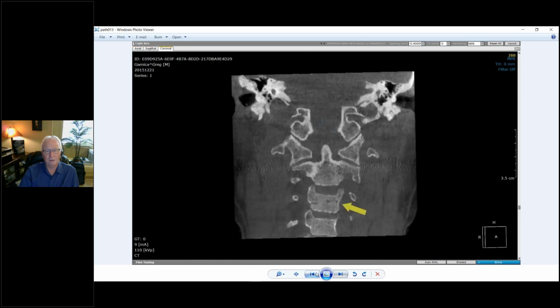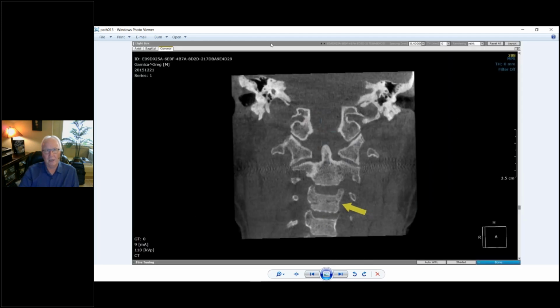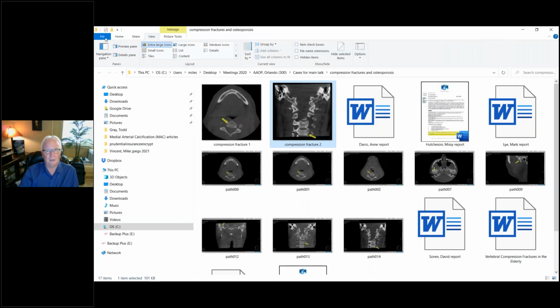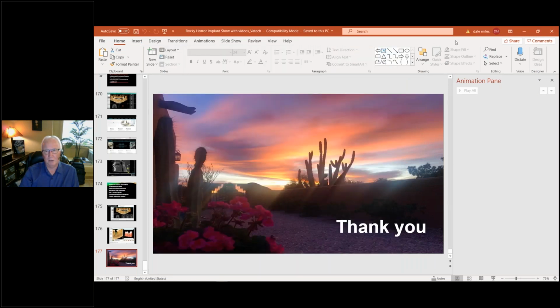I don't have any additional ones. That's up a little bit higher up. The one I showed you was in C4. This is C3. So this bone looks a little osteopenic. You'll be looking more at mandibular bone or maxillary bone, and you'll have to hunt the literature up for that to basically convince yourself that something's going on there.